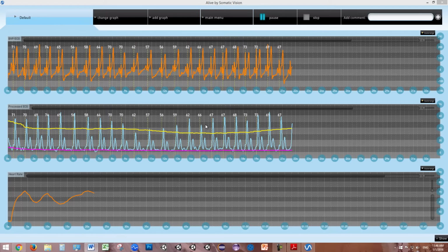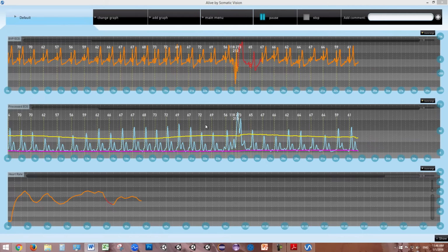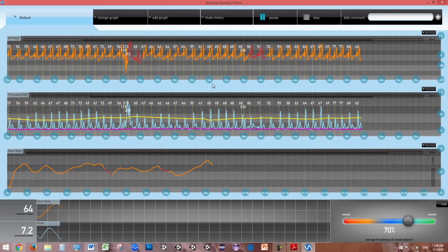If you are measuring ECG at the wrist and move your wrist, you will see a heart rate movement error. Alive attempts to automatically filter these from the heart rate shown in the bottom graph here. You can click the Show button in the bottom right corner to show the Alive bottom bar with the breath pacer and smoothness slider.